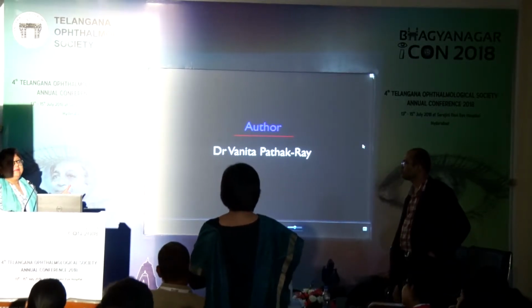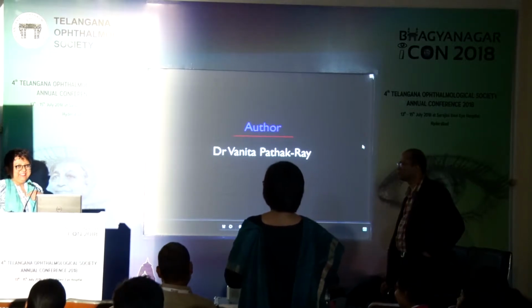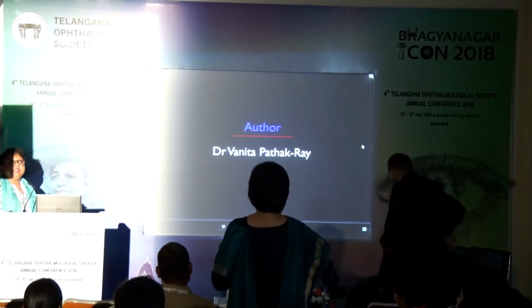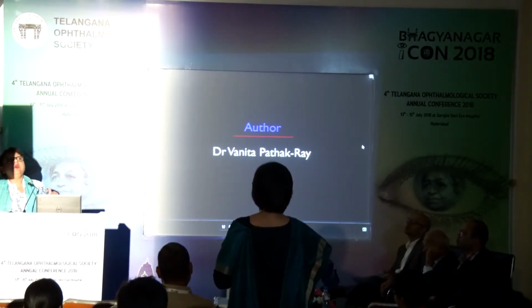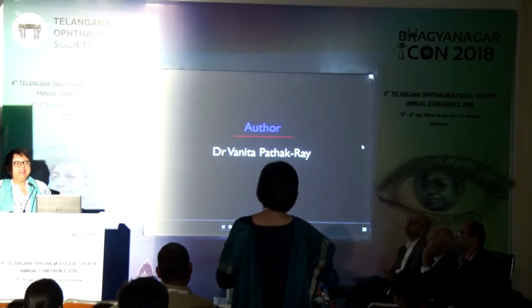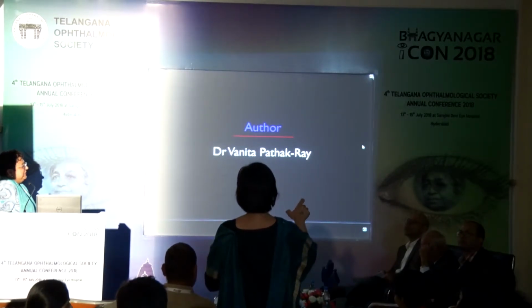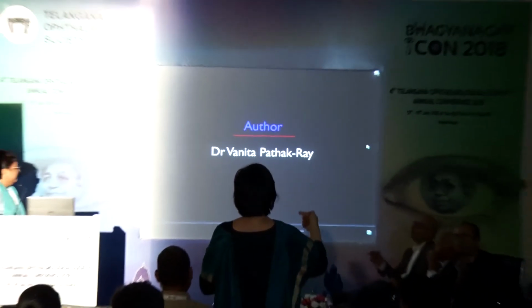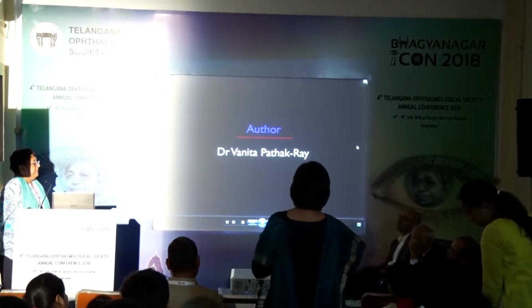So can I just make a point here? You are a posterior segment surgeon, I'm an anterior segment surgeon. What I'm trying to say is that we as anterior segment surgeons can easily manage this condition without actually depending on posterior segment surgeons and the cost it involves. Yes, I'm also telling the same thing. This technique we have published and the video can be followed, and even anterior segment surgeons can use the 25 gauge vitrector even in phakic eyes.